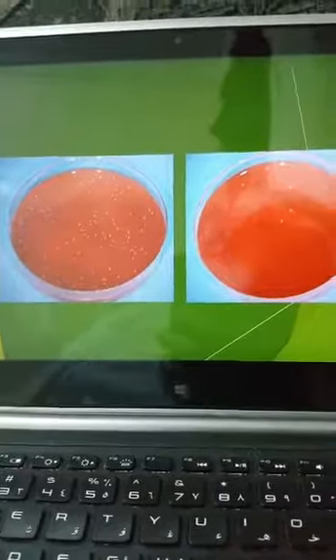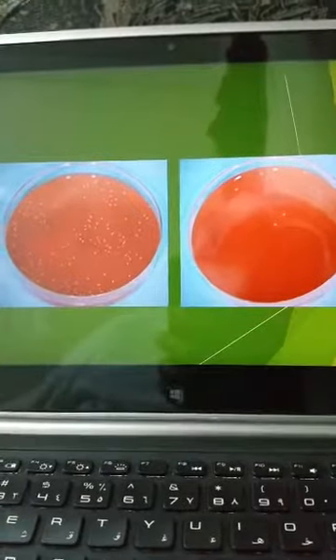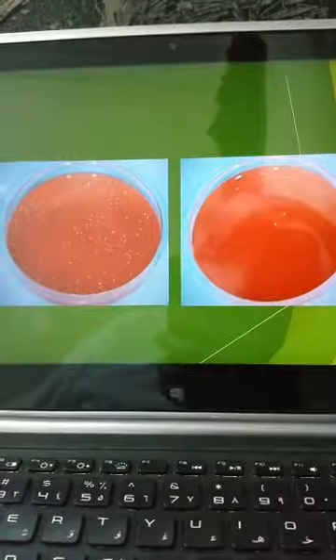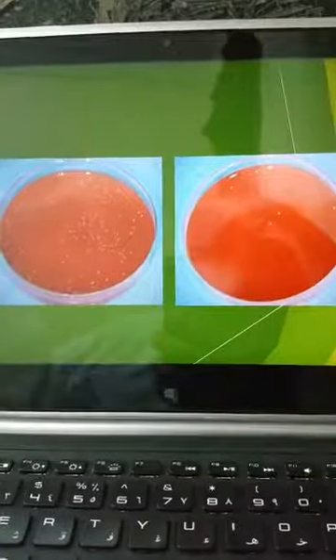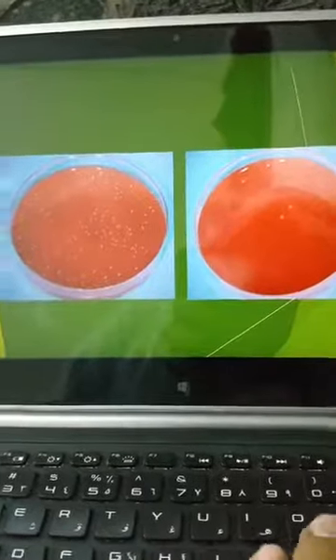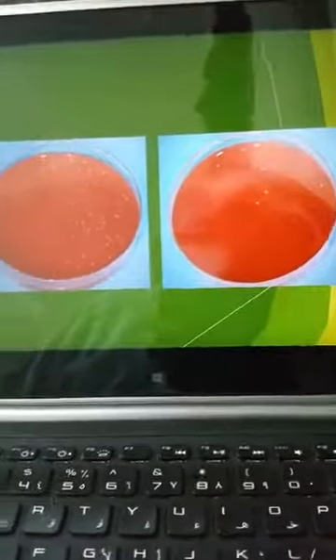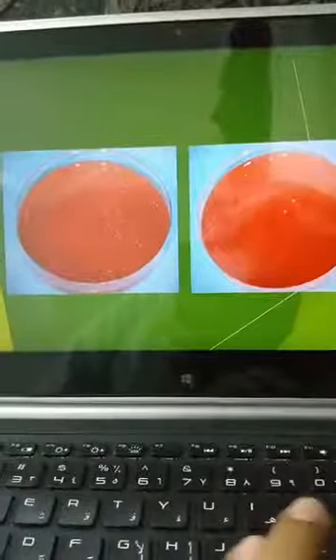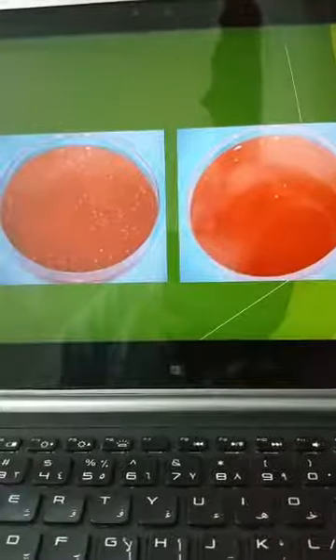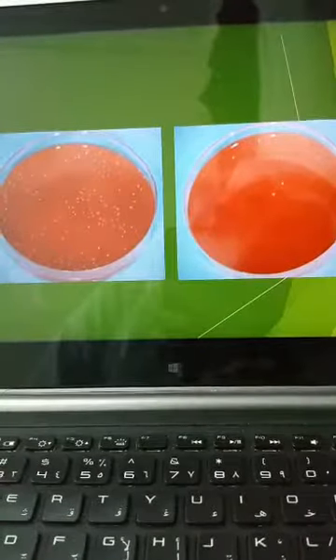Applying laser as endodontic, you are not only cutting, you are also killing bacteria. So we have sterile wounds, whether in implant or also in malignancy or lesions. But I should give the patient antibiotic to avoid any post-operative infection as a routine.